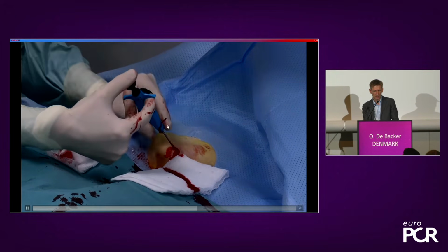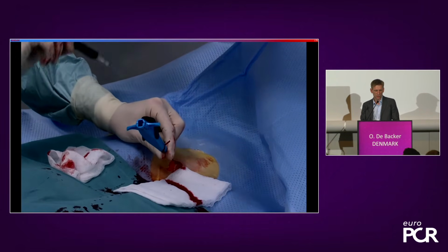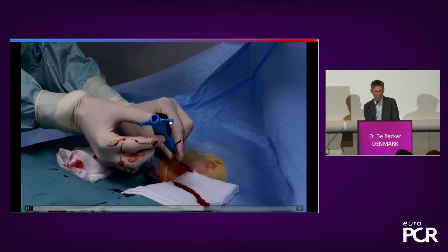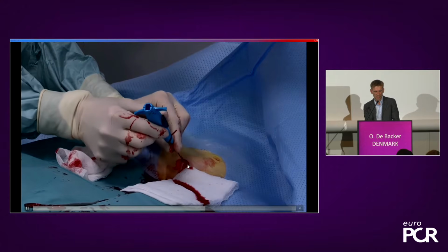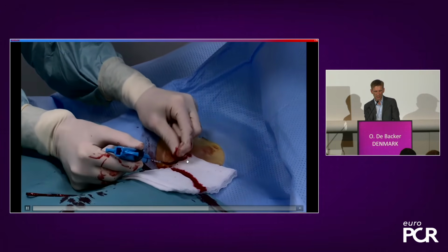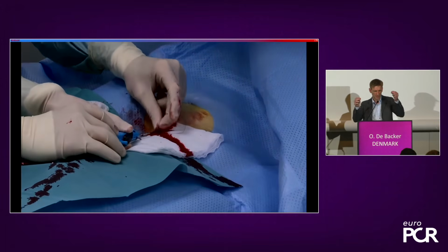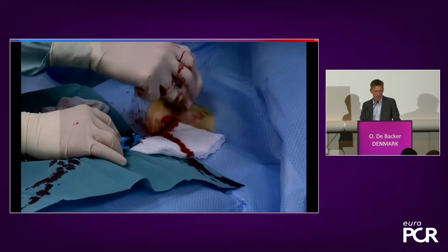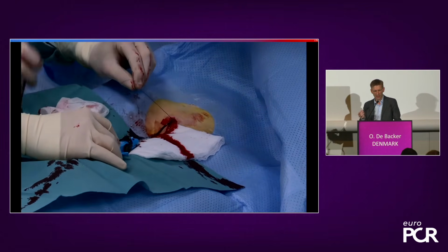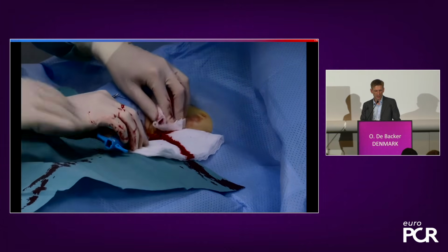Yep. Now the needles have come out, and now I bring out the suture and cut the suture. What I do next is bring this lever down again. I move a little bit into the artery, bring it down, and I pull out so that I see this hub again. I take the two ends of this one suture. It's one suture, but it has two ends. I grab these, I put a small forceps on it, and I pull already a tiny bit on it in the direction of the vessel, of the artery. And then I go for the second one.